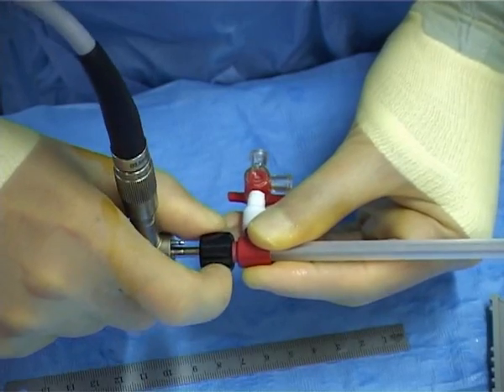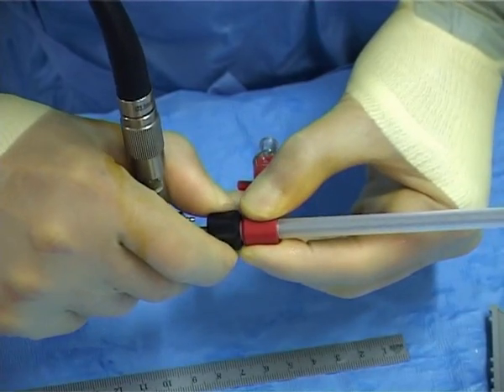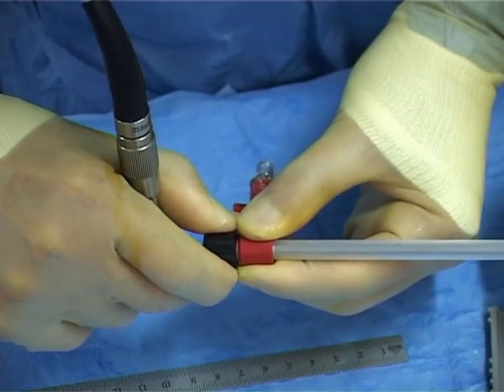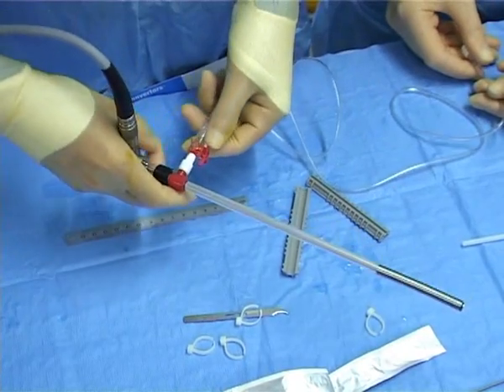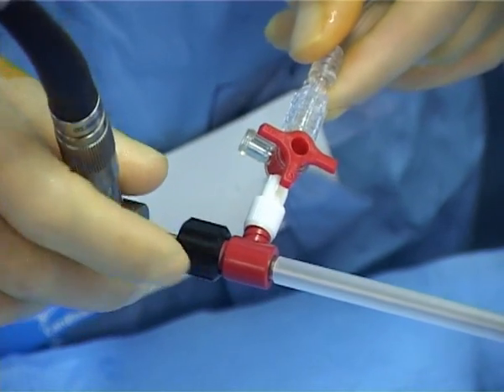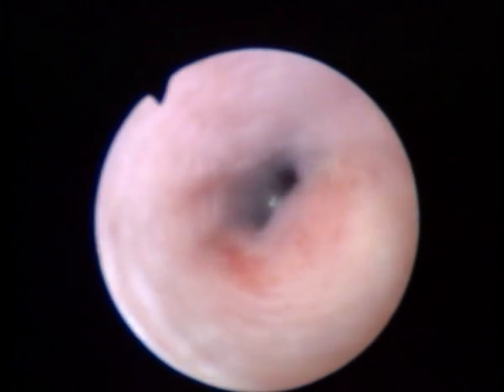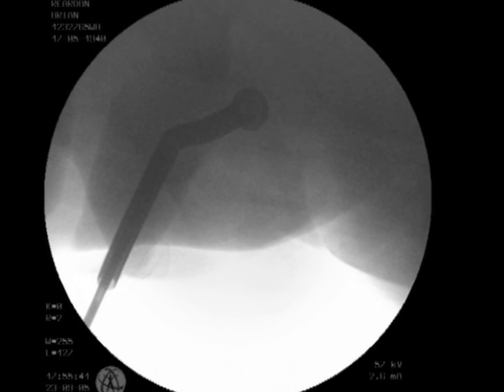The cystoscope is secured at the correct length with the proximal tightening ring. In the correct position, the last 3 windings of the metal stent should just be visible. A feeding tube is attached to the 3-way tap at the side of the assembly. The stent is positioned under cystoscopic control. Fluoroscopy is used to confirm the position.